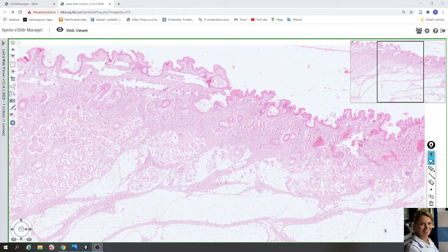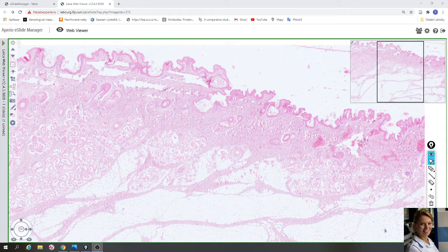In this video we will take a look at the slides of axilla. The slide is stained with hematoxylin and eosin, which means that the nuclei of cells are violet and the cytoplasm is pink.